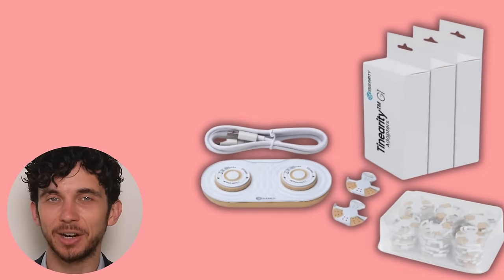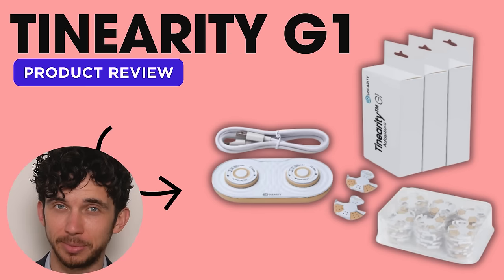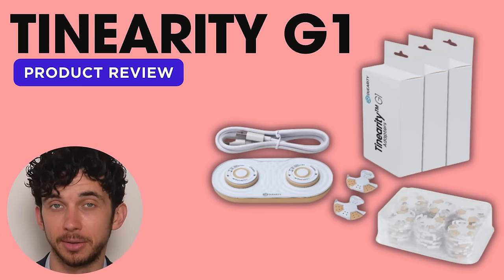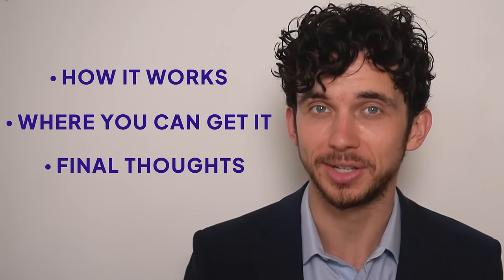Can this new device treat your tinnitus? Today I'm reviewing the Tinearity G1, a device that claims to provide tinnitus treatment with its own version of sound therapy. In this video, I'll explain how it works, where you can get it, and my final thoughts on if this can help you with your tinnitus.